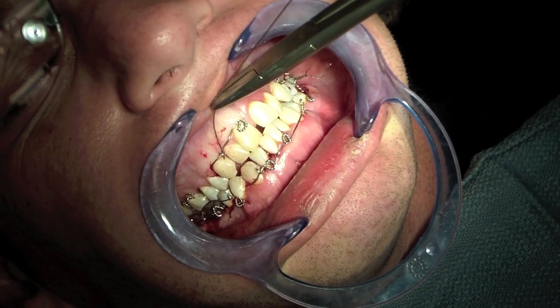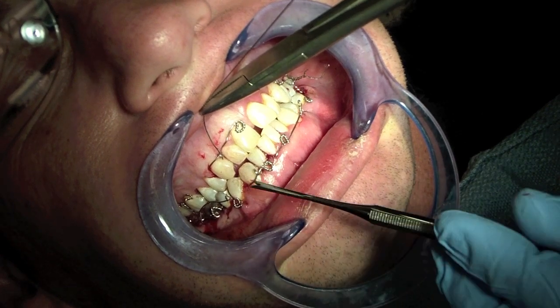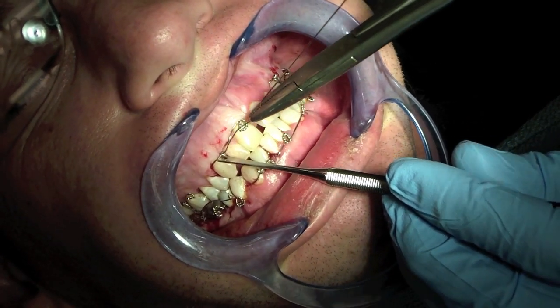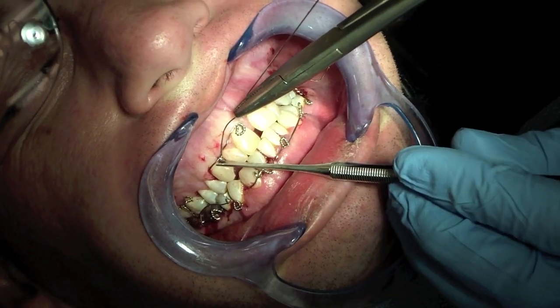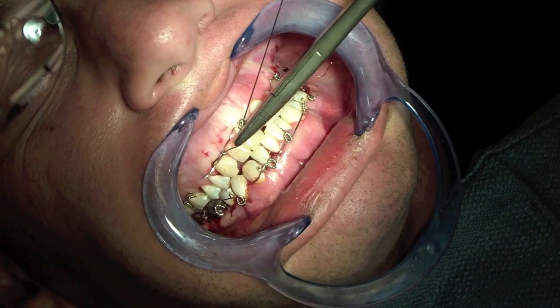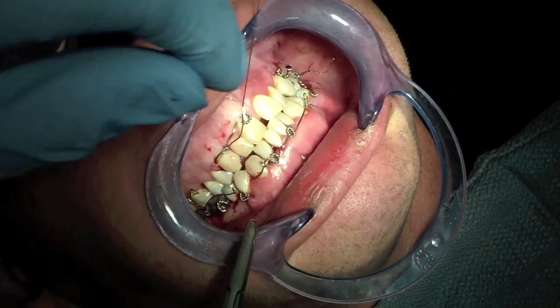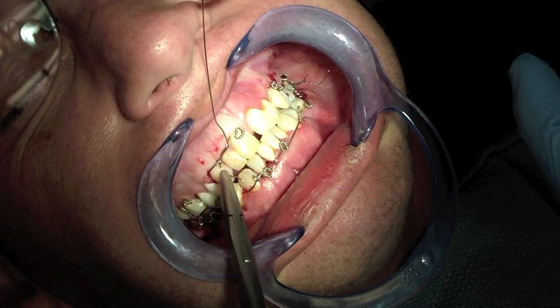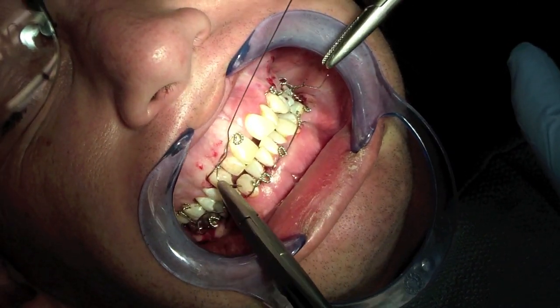I'm using a 26 gauge wire and there's a pickle fork, and what I'm using that for is to weasel the wire through the eyelet because it's getting sort of bunged up on the contour of the canine. So we're going to pull that through the eyelet upstairs and then downstairs we're going to put it through the ivy loop on the mandible.